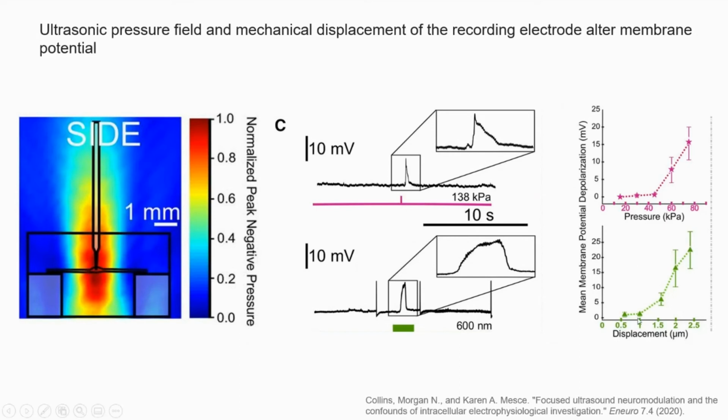And here you can see, he very well mimicked what he saw in terms of depolarization by increasing ultrasound pressure with simply displacing the pipette a number of microns. I would argue that neuromodulation is probably still very possible in this prep, and that he had to use very low pressure, 60 kilopascals, 80 kilopascals. I would really not expect much of a neuromodulatory response at that pressure, but it is nice that they highlighted these artifacts that you can get in that low range.